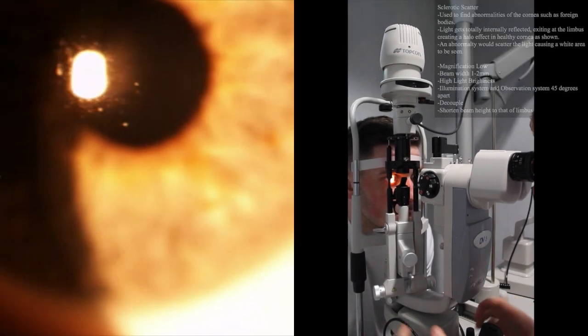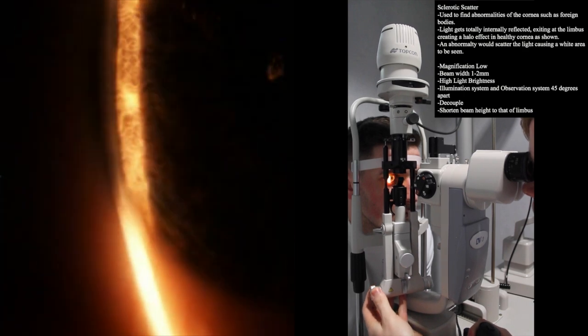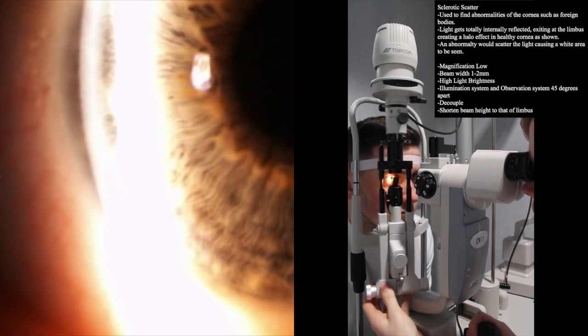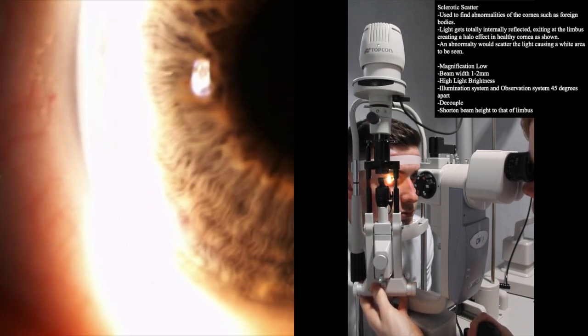To set up the slit lamp for this technique, we set the beam width to 1-2mm with high brightness, separate the observation system and illumination system by 45 degrees, and have the magnification on low.